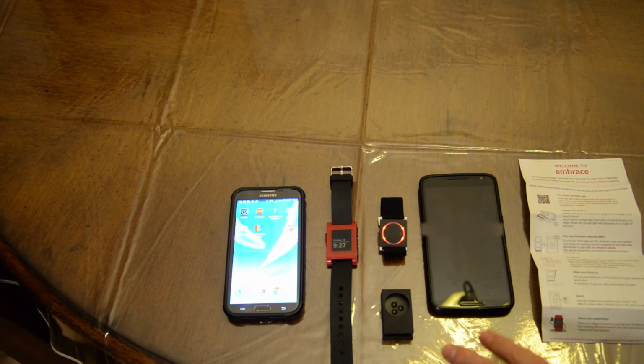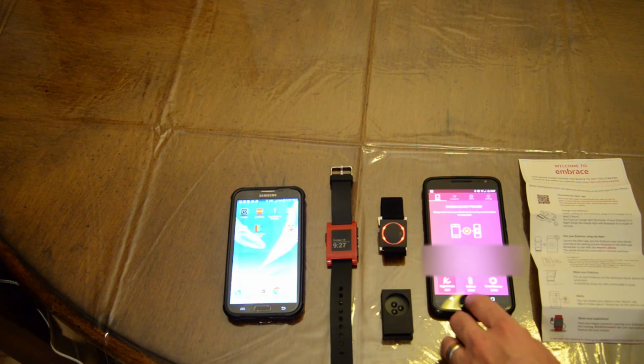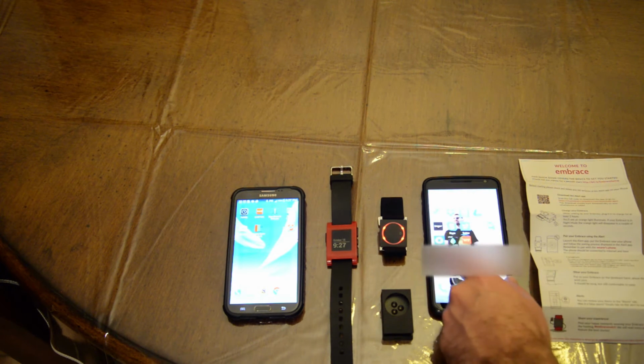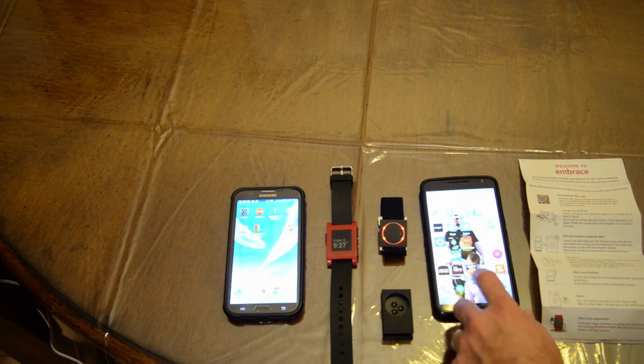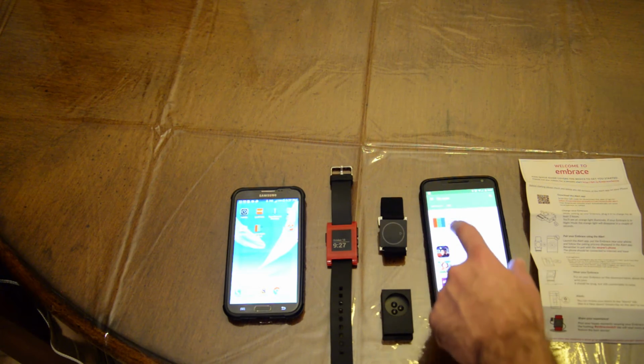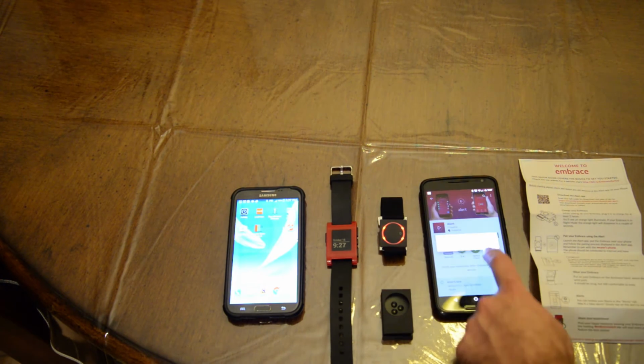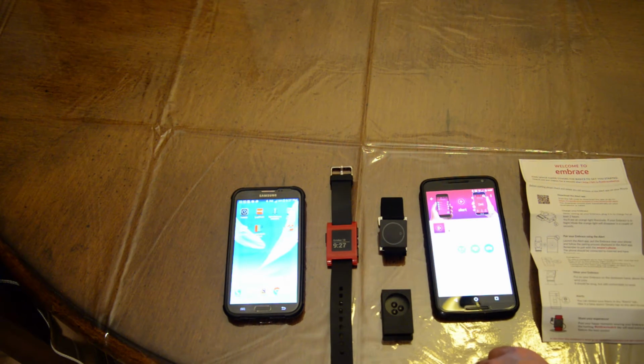We want to start off with a quick tutorial on how to use this device. It's self-explanatory. You just have to download one application in order for it to work. In our case, it would be this app. It's called Alert Empatica. I'm going to uninstall it and reinstall it to give you a fresh start.